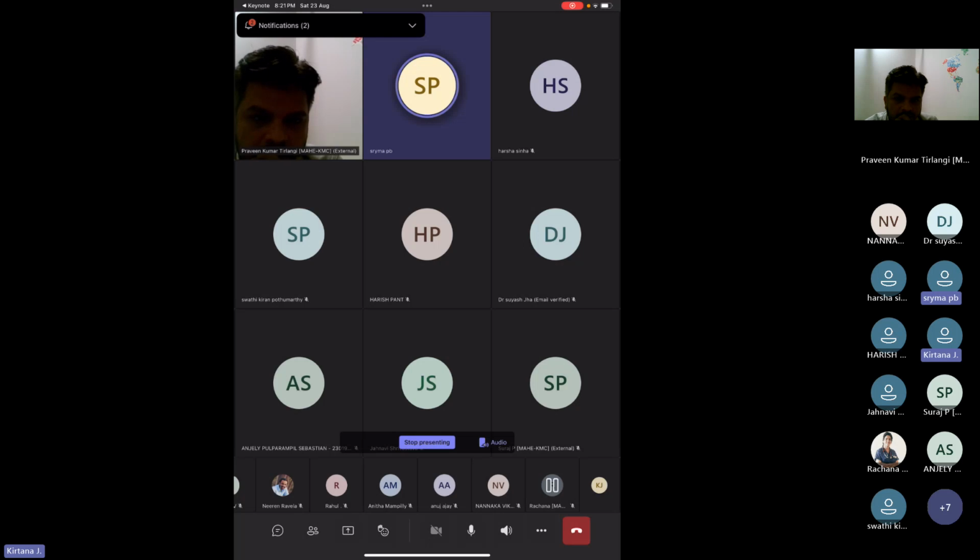So as I said, the PEEP FiO2 table is the starting point. If a patient is in shock, obviously I wouldn't directly put a high PEEP, even if it is severe ARDS. You would first stabilize the patient. I would start with the low PEEP FiO2 table, stabilize the patient, and do the rest of the things. And generally, in the first few hours, if the patient is not going to improve, and most of our patients have a usual normal BMI or a lower BMI, they are not very obese, in which case you can safely give a high PEEP.